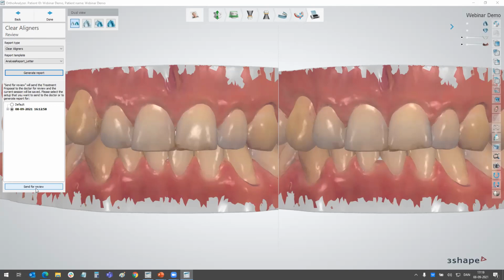Do we receive an install guide? Yeah, I think that's on the partner portal. The installation process is actually the same as the old one, but you'll only get one icon on the desktop. So things have become a little bit easier that way, but otherwise it's the same. Also, regarding all the integrations to practice management systems and all that, that's also identical to the previous version.